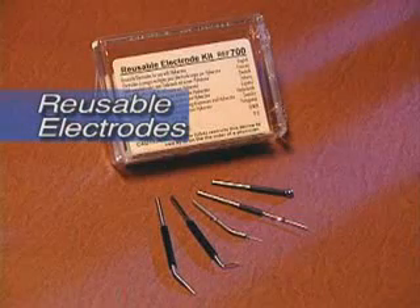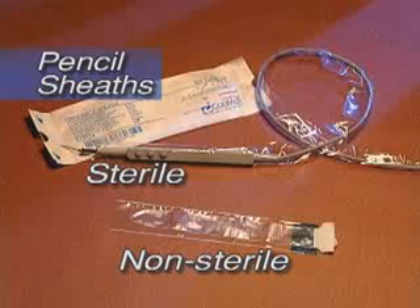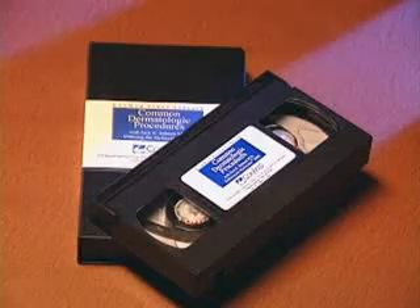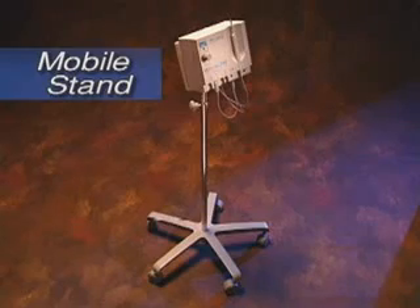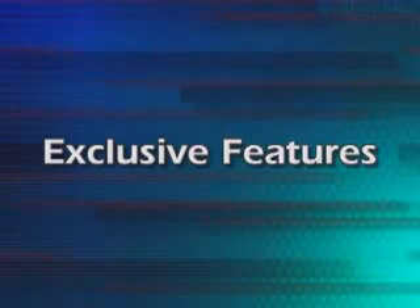A wide variety of single-use and multi-use electrodes. Sterile and non-sterile pencil sheaths. A videotape of common dermatological procedures. A mobile stand which allows you to move the Conmed Hyfrecator 2000 around more freely. The Conmed Hyfrecator 2000 is the number one choice among physicians performing desiccation, coagulation, and fulguration procedures.